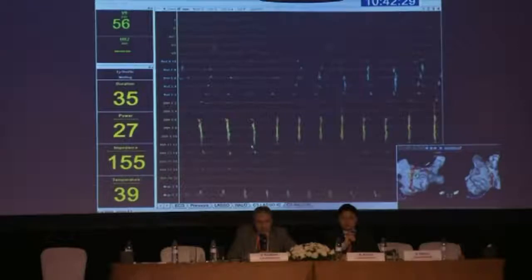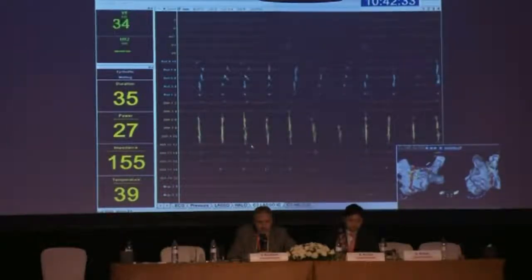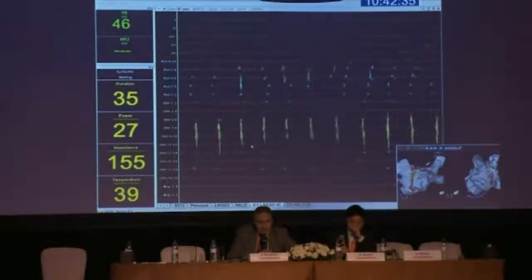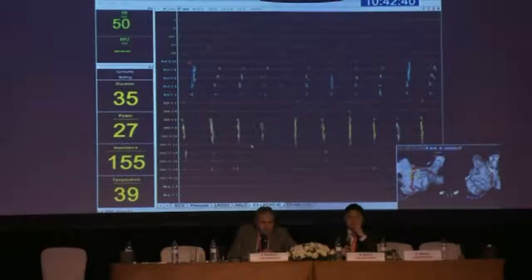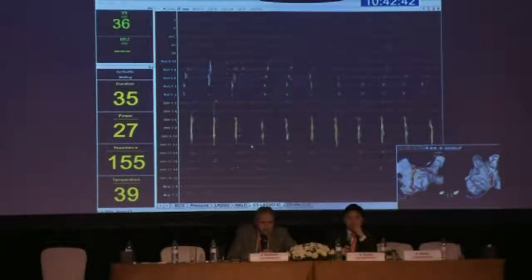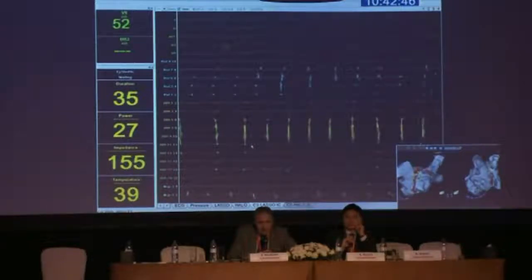So I'm on the upper vein side. And there you see the way it flicked off there? So you can see I'm really very, very close to the edge of the vein there, so I'm not going to be ablating a significant distance into the pulmonary vein. So I'll just try and get back onto that position while you talk, Joseph.